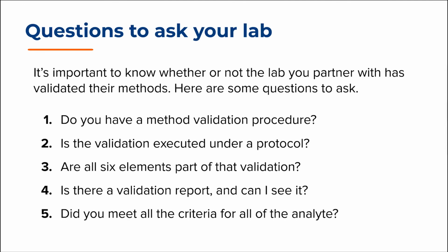So that wraps up the validation. The final step is to collect and analyze all the data and then write up the validation report. As stated previously, the validation report must summarize all the results and assess the results against the acceptance criteria stated in the protocol. Lastly, the report must make a final assessment of the method's validated status.